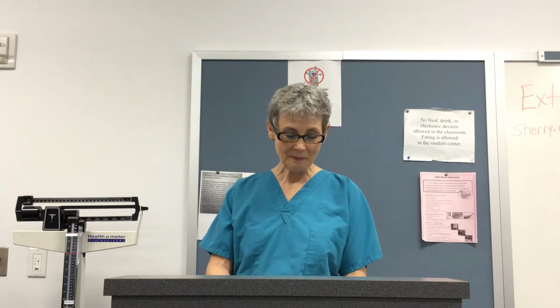Okay, now then, I'll get off my soapbox about the air in the tubing. I certainly don't want air in my tubing, and I don't want air in my patient's tubing. And I hope that'll be your goal too, is to never have any bubble, no matter what size, no matter how small, to always have tubing that's free of bubbles.